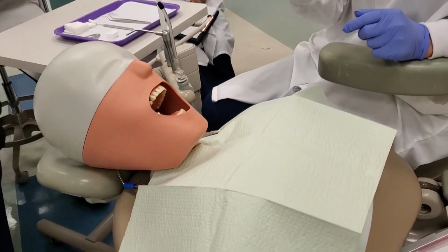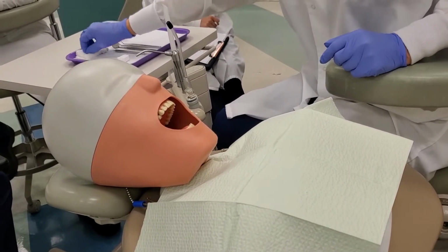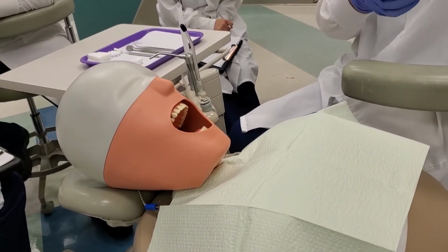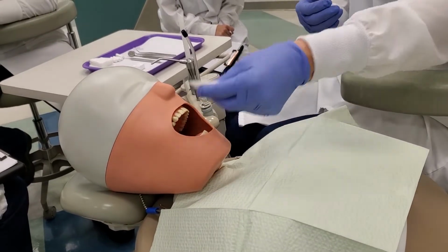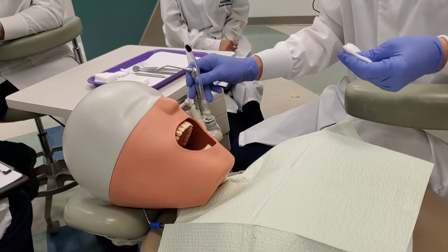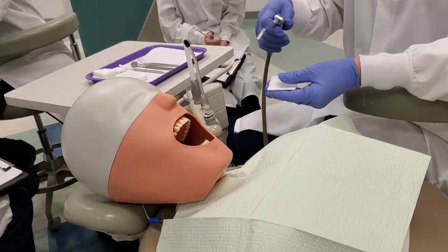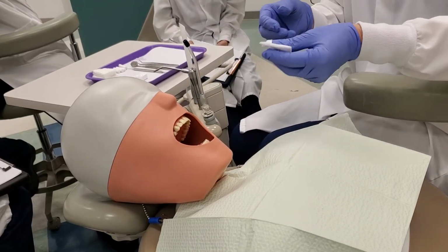And then use your fingers with wet gauze to retract the upper lip. Anytime that you put in any type of absorbent in the mouth, if you're putting it in, taking it out, it has to be wet before you take it out. So since you're using this for retraction, you're just going to wet it a little bit, because you're going to be using it to retract the tissue.